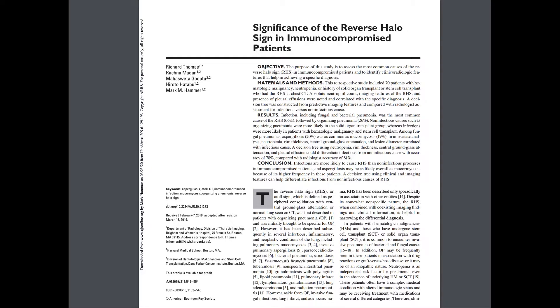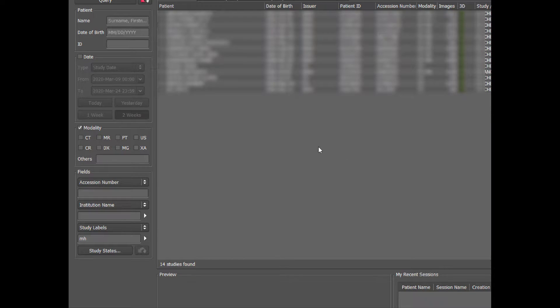There are three main important entities to remember for the reverse halo sign: organizing pneumonia, pulmonary infarcts, and infections. Particularly in immunocompromised patients, you want to think about mucormycosis. We'll get to the infections in a bit. Let's start off by looking at some cases.